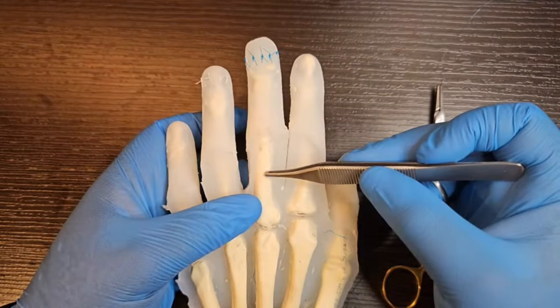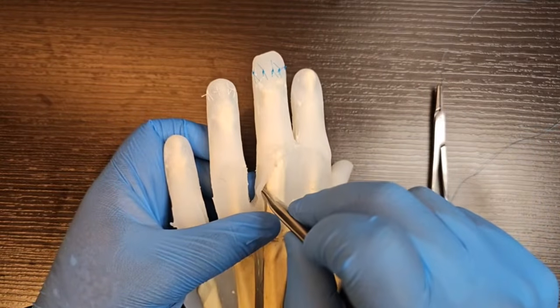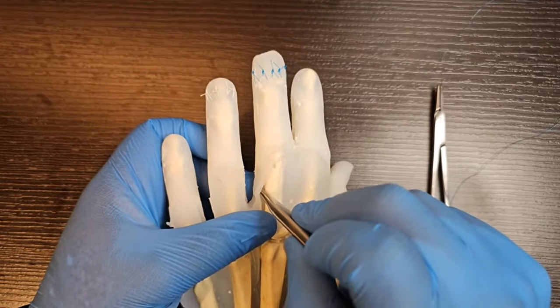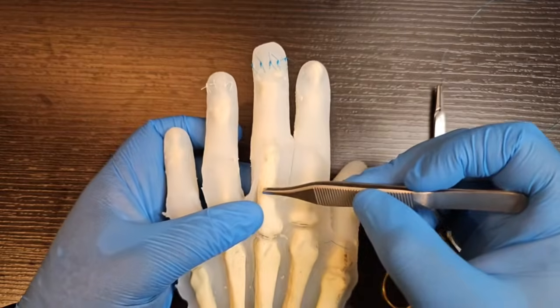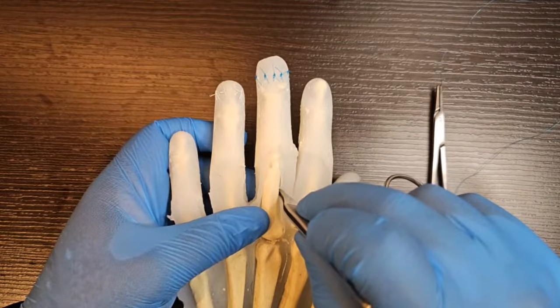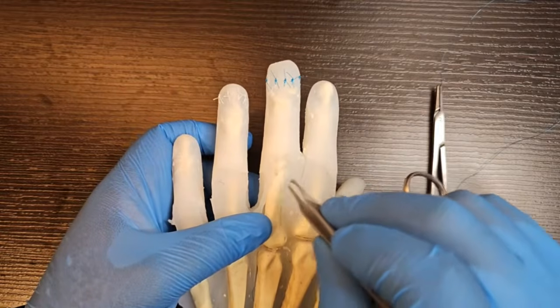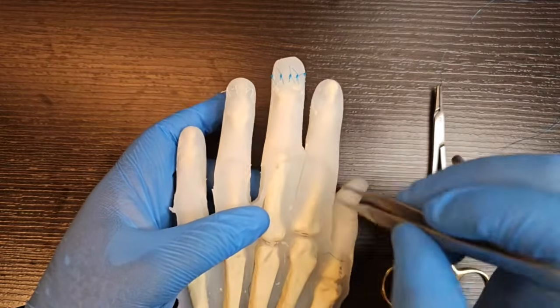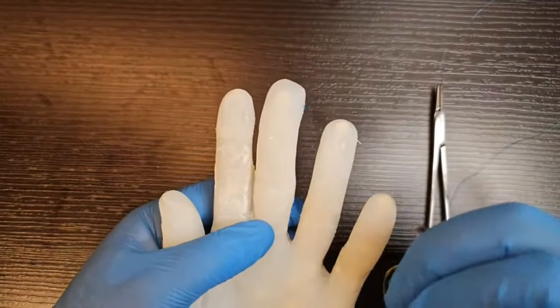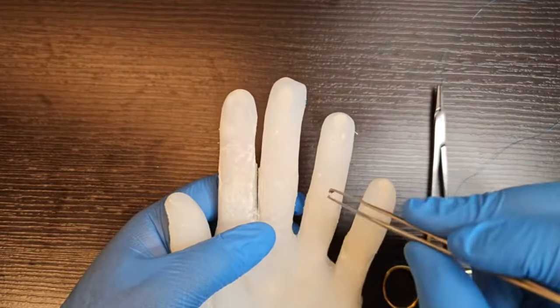I inject a bleb. I will then proceed with the needle down the side to get to the volar side. Aspirate before you inject, because the digital artery is what you'll come across first, and the digital nerve. Then I inject. I withdraw that needle back through the hole. I then go vertically and come down here and inject, aspirating first, then injecting. That way we usually get the nerves on the volar and the dorsum for the most part. Let that work for a minute, and then I turn over. It will still be a bit tender, but this is how I do my ring blocks in general.